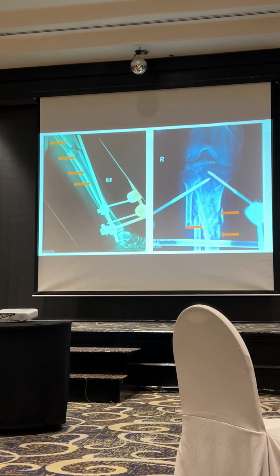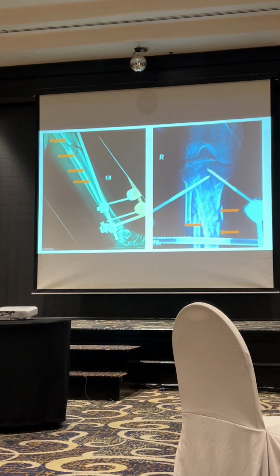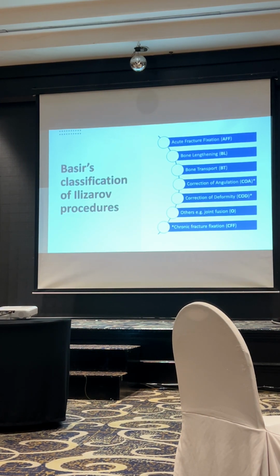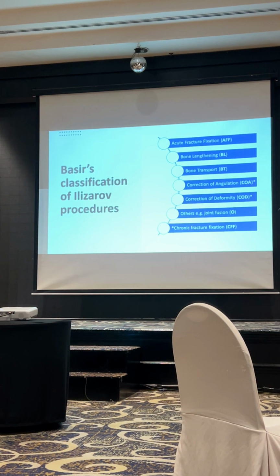and distal part of the tibia, and in the AP view you can see possible sequestral osteomyelitic changes as well. Next. How long he kept the patient? Almost 6 weeks to about 2 months, so close to 2 months. So when he was referred, infection has already settled in. Okay, we shall go back to the fate of the patient later.